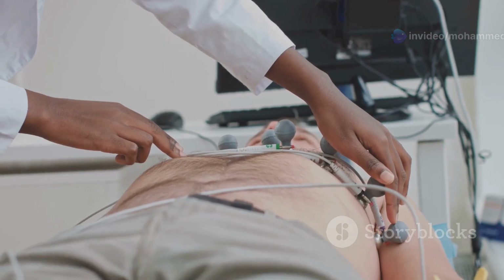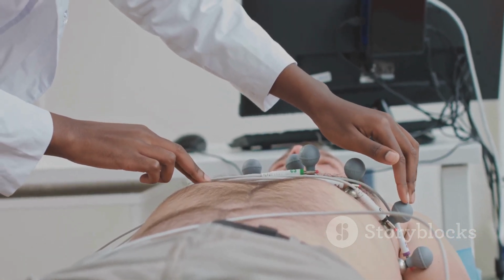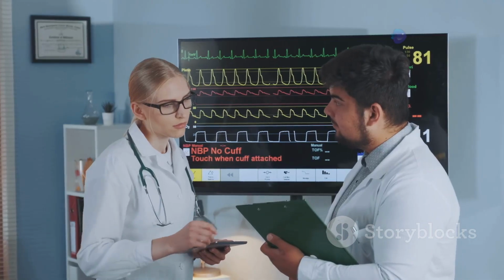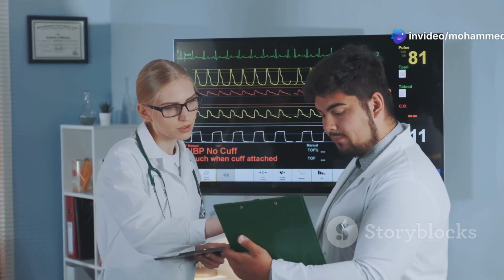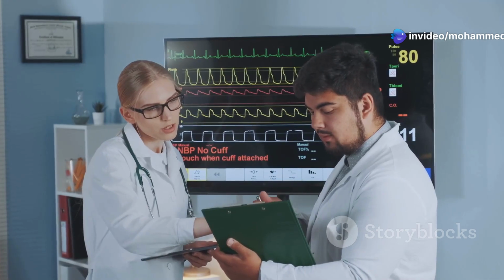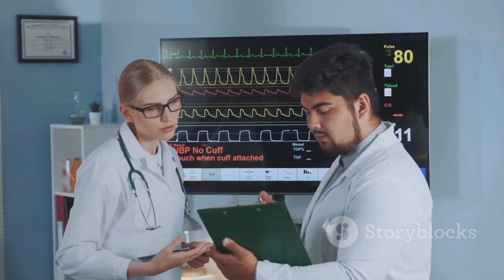ECG leads are like different angles of a camera, capturing the heart's electrical activity from different perspectives. By analyzing the ECG from these various leads, doctors can pinpoint the location and extent of heart damage, or identify the origin of an abnormal heart rhythm.